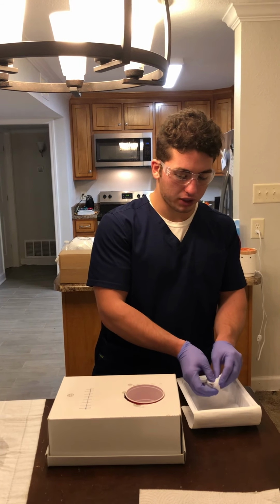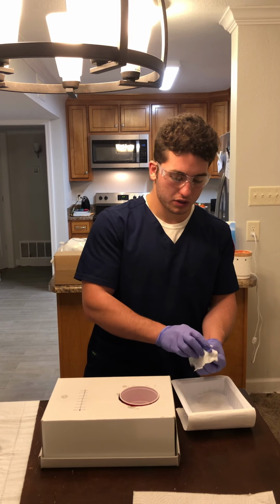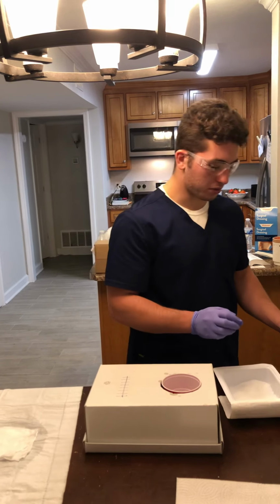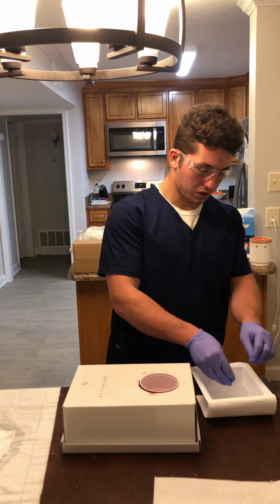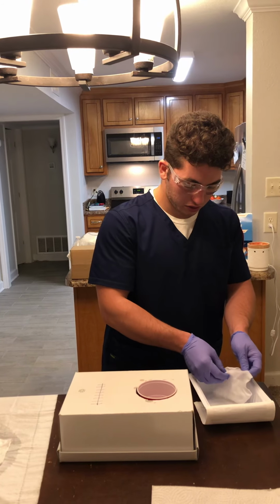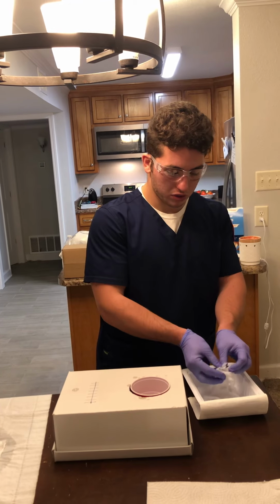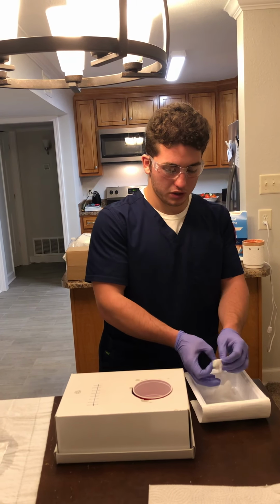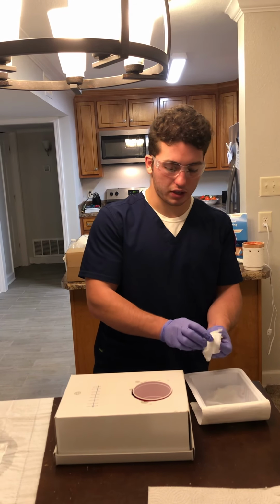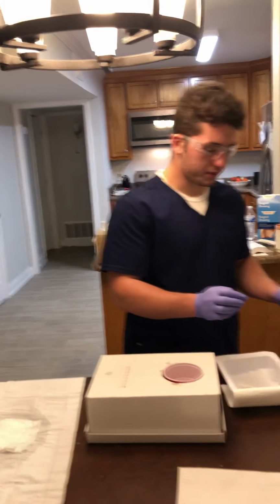Now I'm going to repeat this process for both sides of the suture line as well. Glove hand not touching the patient's skin, dispose at waist level. Wring out. Gloved hand not touching the patient's skin. One swipe, dispose at waist level.